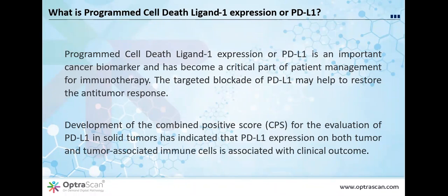The FDA mandated in these clinical trials that as the antibody went into clinical trial, it had to enter trial with a companion test. This recognized the fact that not all cancers overexpress PD-L1, only those that do overexpress it would be expected to respond to therapy, and therefore it was necessary to find out which cancers would respond to therapy or be likely to respond and which ones would not.